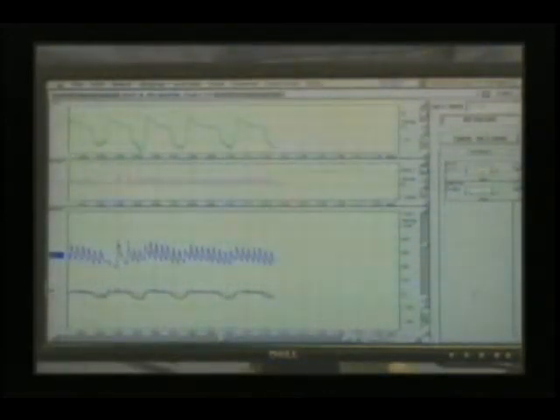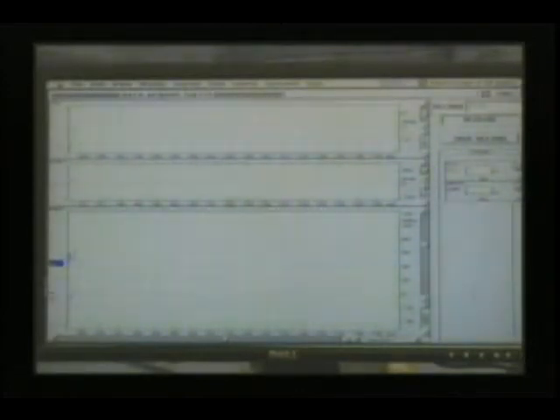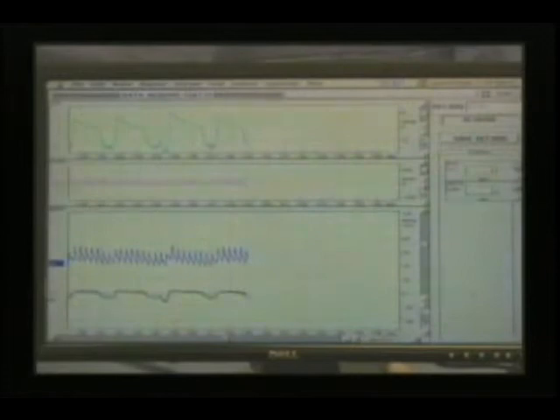Note that with each inspiratory effort, both the intracranial pressure and the right atrial pressure decrease. In this case, the intracranial pressure decreases from about 5 millimeters of mercury to about -2, and the right atrial pressure decreases from about 5 millimeters of mercury to about -8. This pig will remain hypotensive, but with reasonable perfusion to its heart and brain. In this way, we allow for permissive hypotension when treating this severity of blood loss in this pig model.